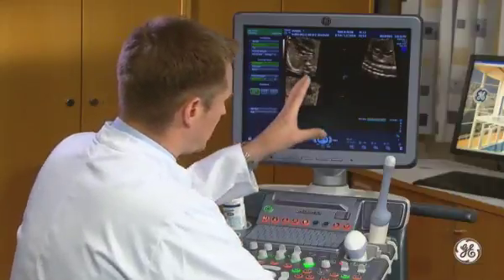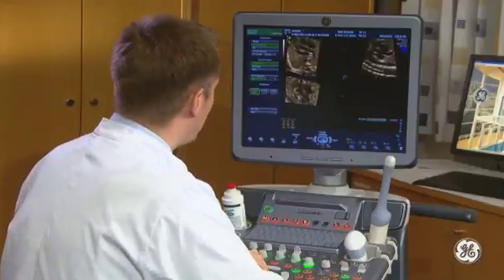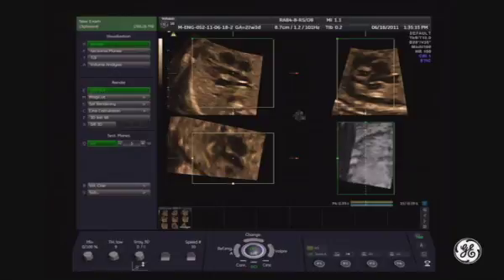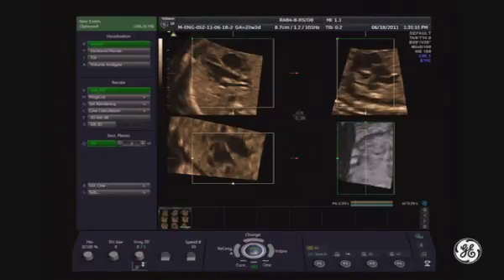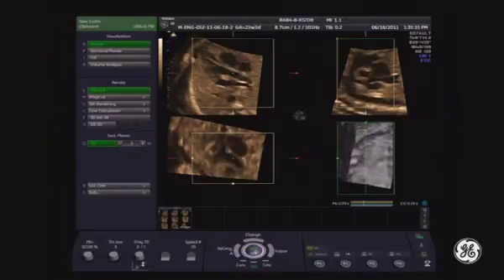You see that I'm arranged in the center with my pivot point in the B-plane, and I start with rendering. In rendering, you have a region of interest in all the three planes, and we need to adjust it according to the target. In this case, we'll try to make a deeper perspective at the level of the four-chamber view.